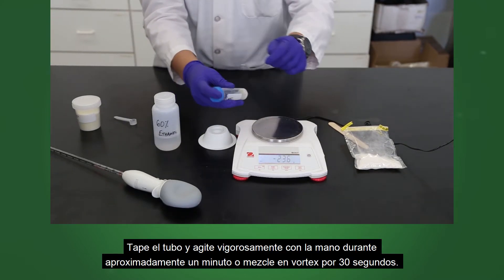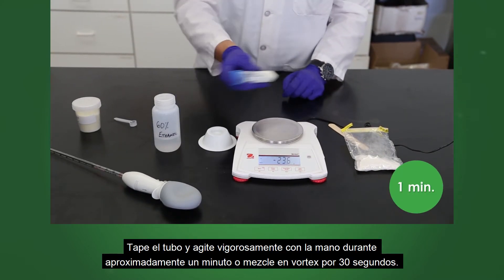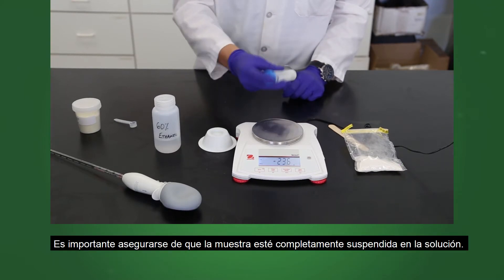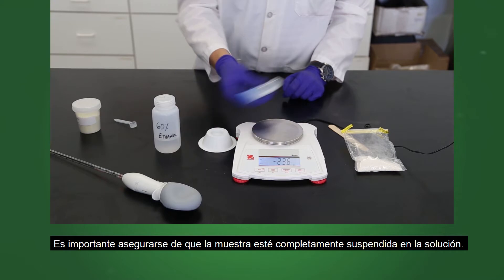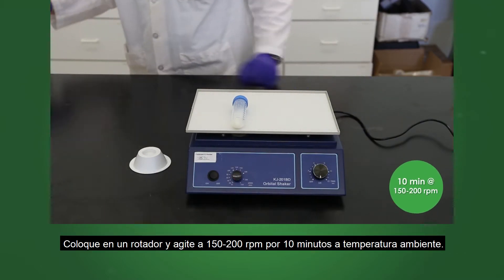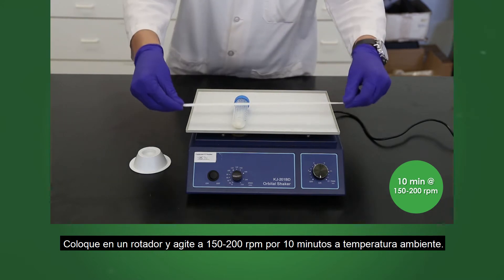Cap the tube and shake vigorously by hand for about 1 minute, or vortex for 30 seconds. It is important to make sure the sample is completely suspended in the solution. Place on a rotator and shake at 150 to 200 rpm for 10 minutes at room temperature.